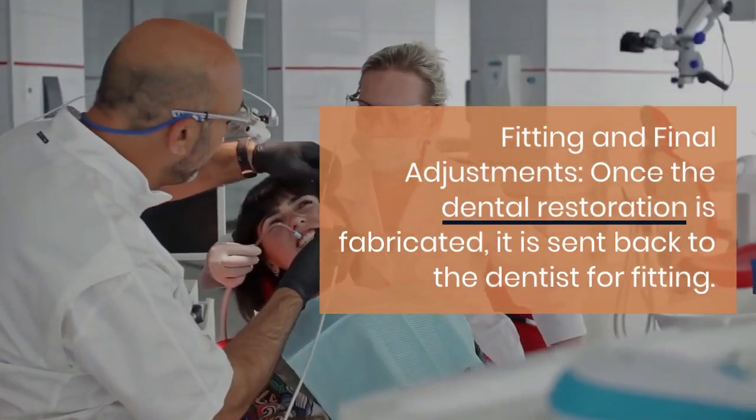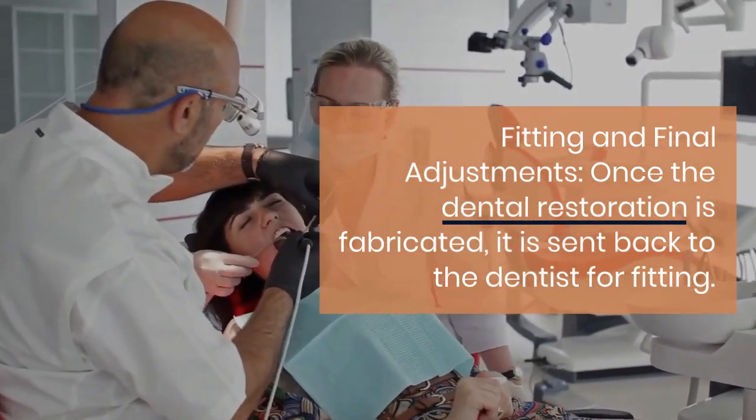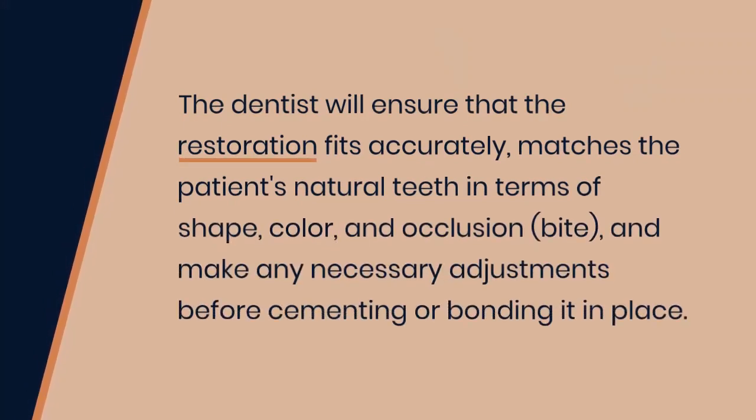Fitting and final adjustments. Once the dental restoration is fabricated, it is sent back to the dentist for fitting. The dentist will ensure that the restoration fits accurately, matches the patient's natural teeth in terms of shape, color, and occlusion, bite, and make any necessary adjustments before cementing or bonding it in place.